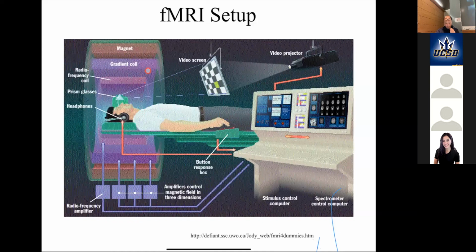fMRI is essentially like MRI, except that in a lot of fMRI experiments, the subject is actually doing something or having something done to them. They might be playing a video game. They might be having pain applied to them. For example, there are experiments where really intense heat is applied to them, and we see what the reaction is. We might investigate them with caffeine, and see what the effects of caffeine are. So there are lots of different experiments. Essentially, as that thing from Homer Simpson showed, anything you can think of has probably been done, or someone is thinking of the experiment. Okay.